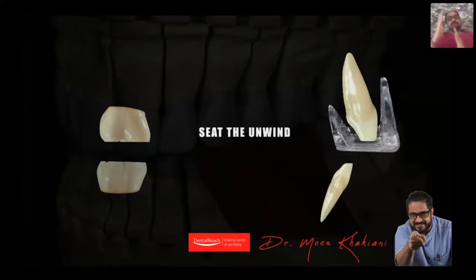The longer face is labial, the shorter face is towards the palatal, and the upper 2 central incisors go and fit in. I now reline this with either a bite registration paste, or very frequently in my practice, I do this with cold cure acrylic, the clear powder liquid that we have. The same is relined and placed into the patient's mouth. It can be removed by the patient.